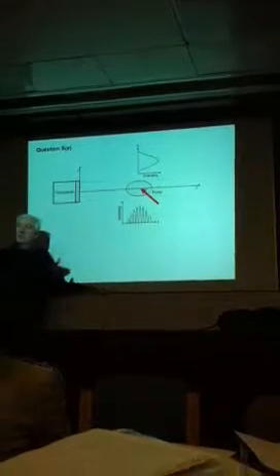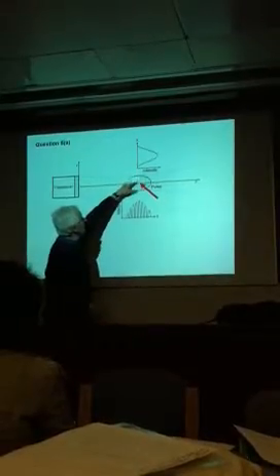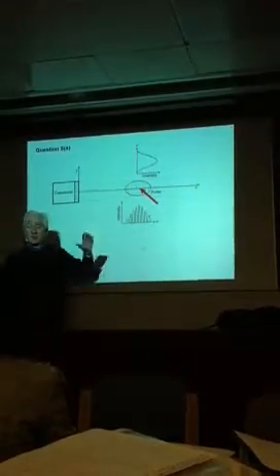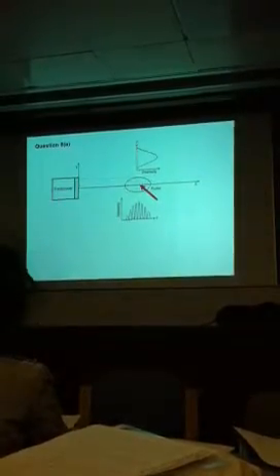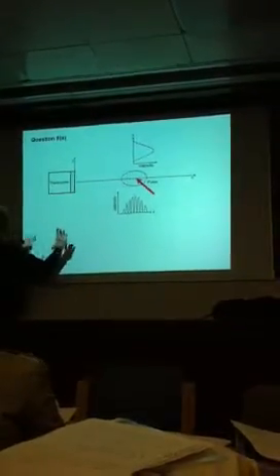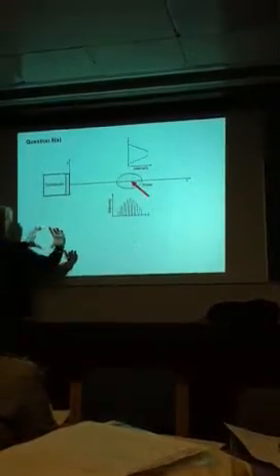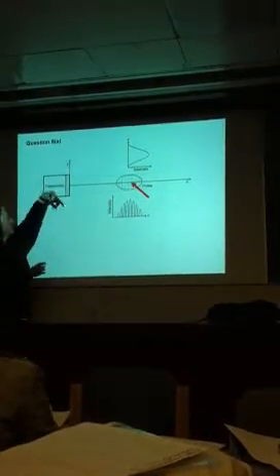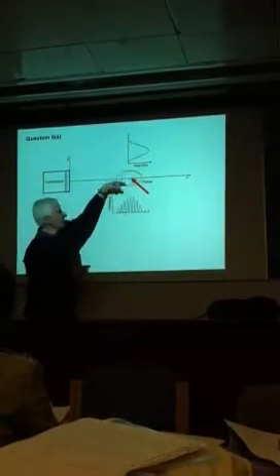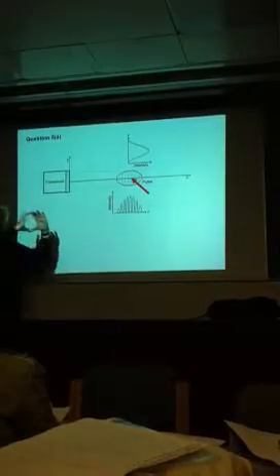Within the other dimension, parallel to the surface, these profiles will be quite smooth. So a pulse profile is a series of smooth disks, if you like, of different size, travelling throughout the medium. If this is a circular transducer, then these will be circular as well. So you've got to consider that there's a series of circular regions travelling through the tissue.